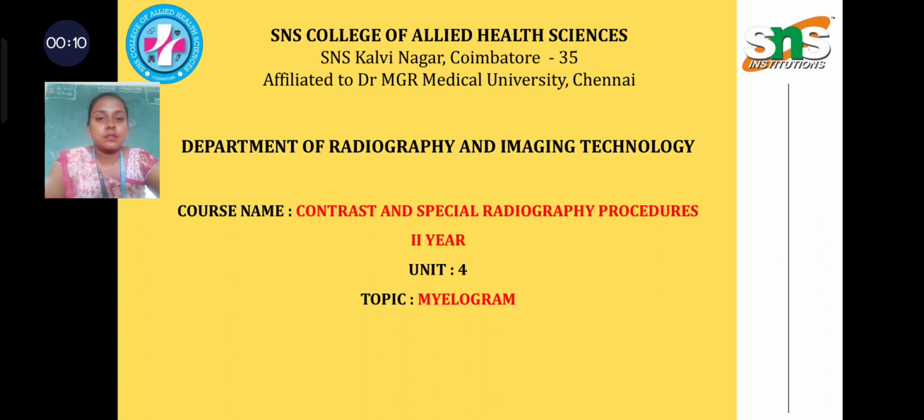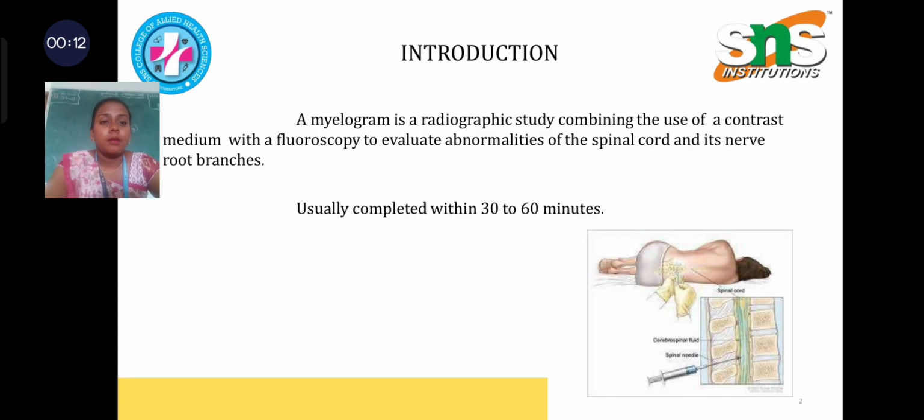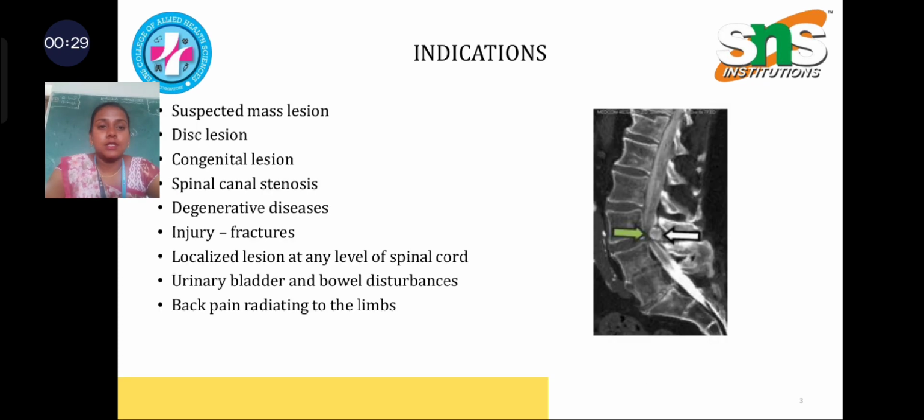I am going to discuss a topic about myelogram. Myelogram is a radiographic study combining the use of contrast medium with a fluoroscopy to evaluate abnormalities of the spinal cord and its nerve root branches. The procedure is usually completed within 30 to 60 minutes.